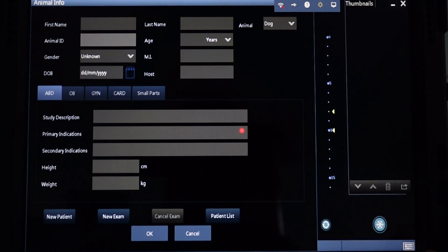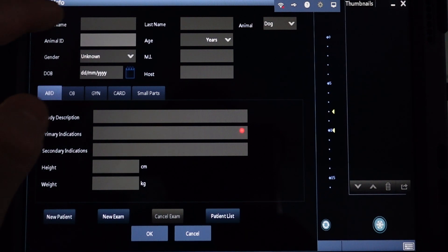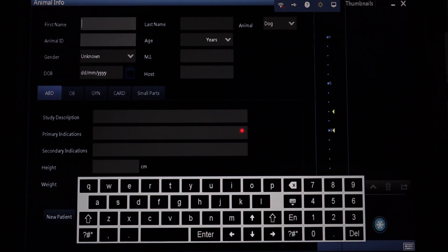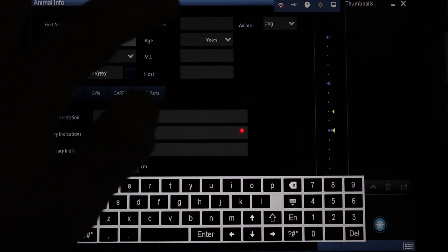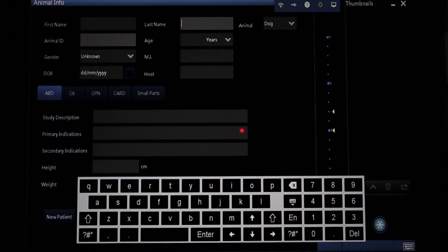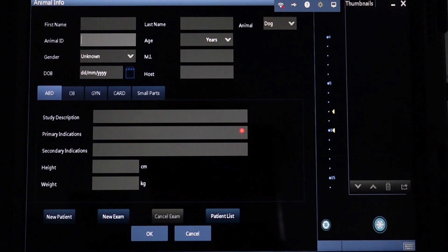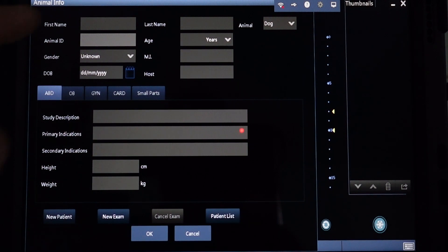Now, as long as the keyboard is highlighted at the bottom right hand side of the screen, when you click First Name, a keyboard will appear. This will similarly appear as you cycle through the options. Just note: if the keyboard on the bottom right of the screen is not highlighted, the keyboard will disappear. So if your keyboard is not appearing, just make sure on the bottom right hand side you have clicked the keyboard.